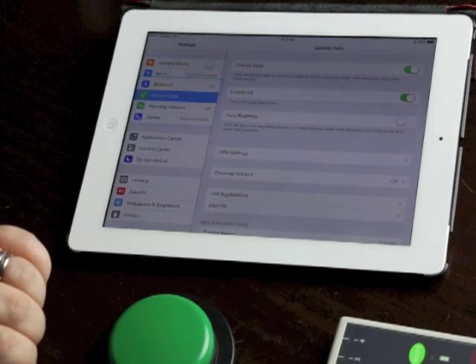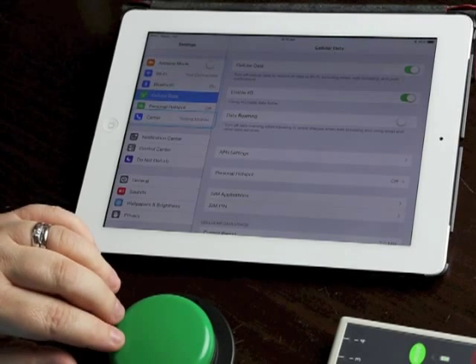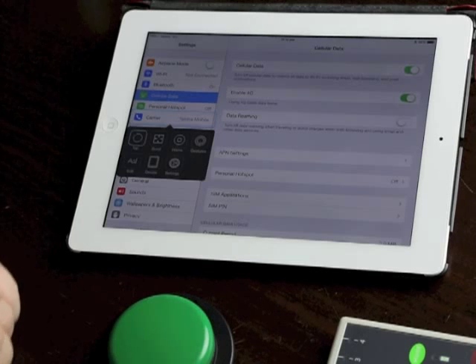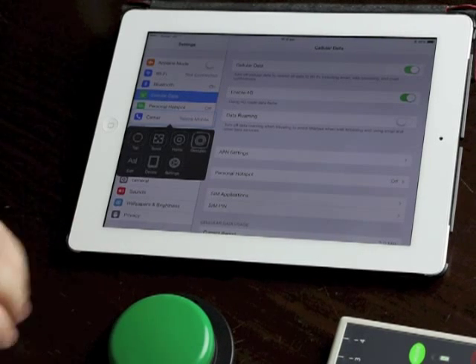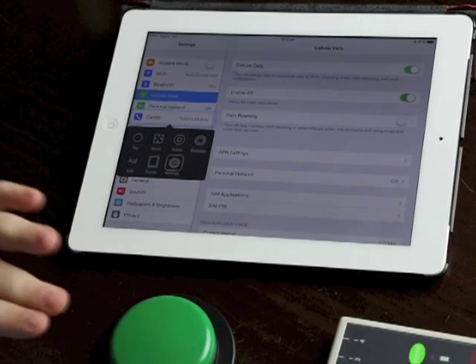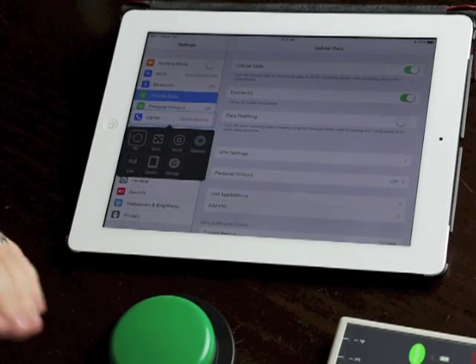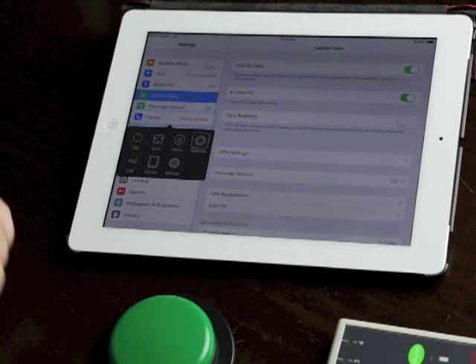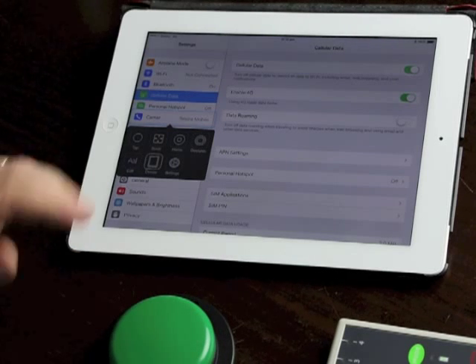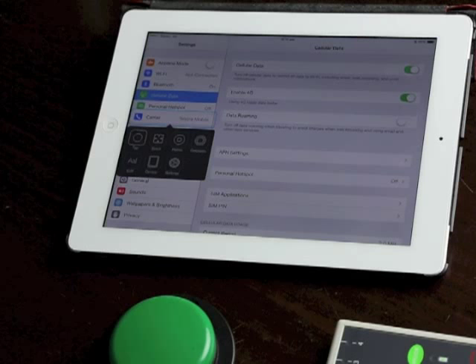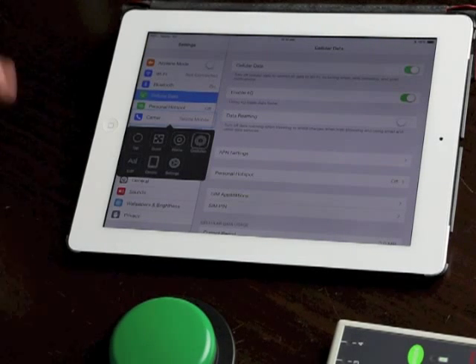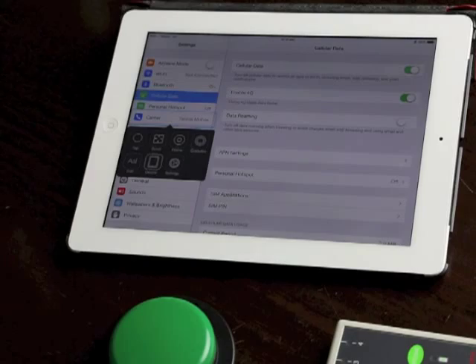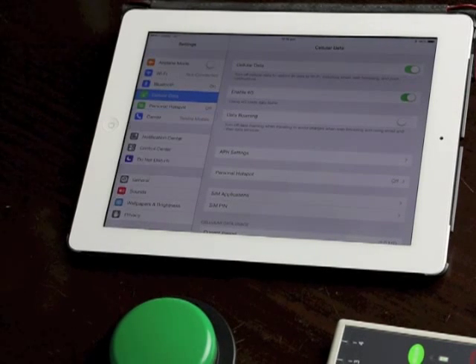And in that time, if you press the switch again, the menu will pop up. So there it is. So if you don't want to always have that menu popping up, that's an option for turning it off. But you're going to need quite quick timing to be able to launch the menu. You can change that 0.75 seconds is the default, but you can increase that if you need a bit longer. But if having that menu pop up all the time is not your desired outcome, that's the way to get it off and still have access to it when you need it.